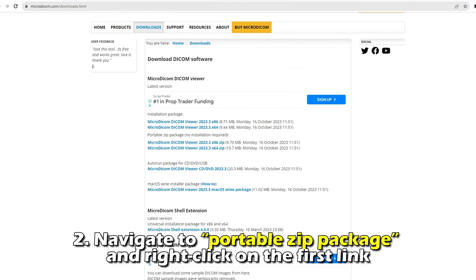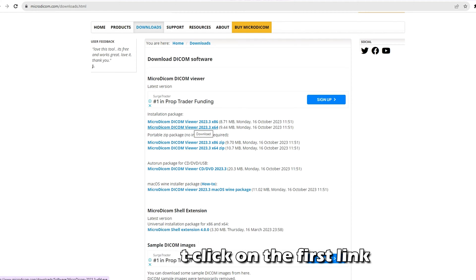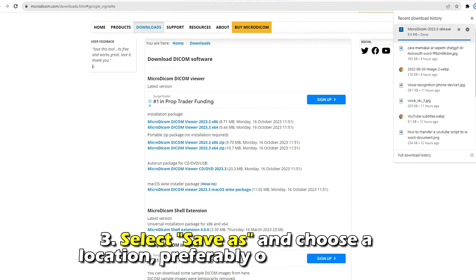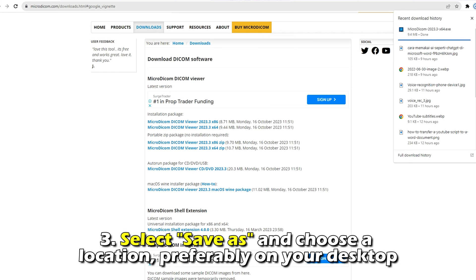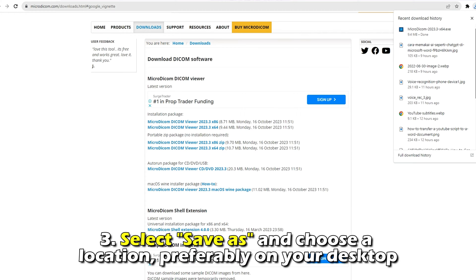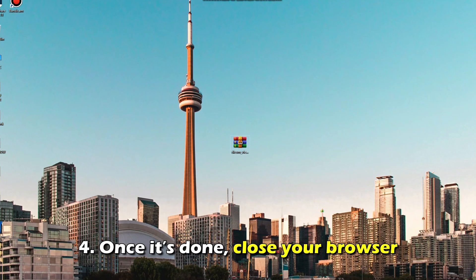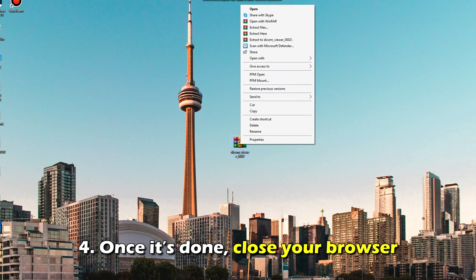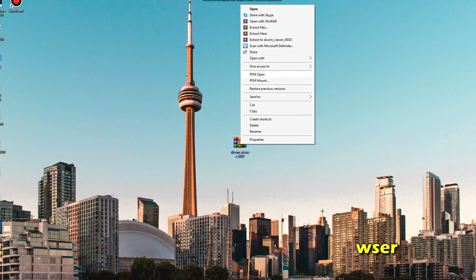Navigate to Portable Zip Package and right-click on the first link. Select Save As and choose a location, preferably on your desktop. Once it's done, close your browser.